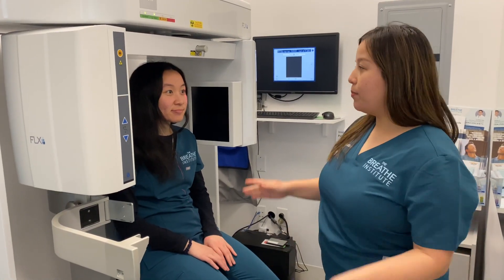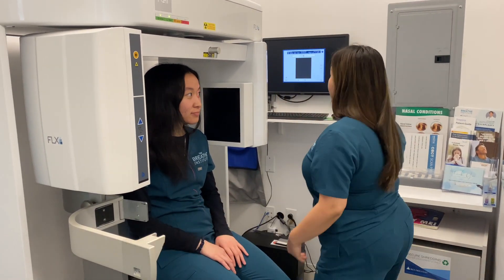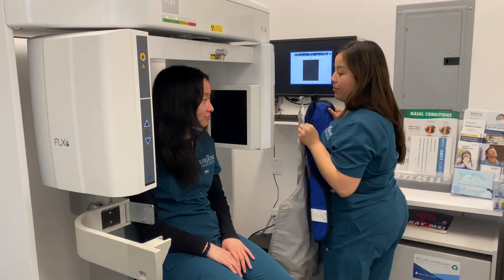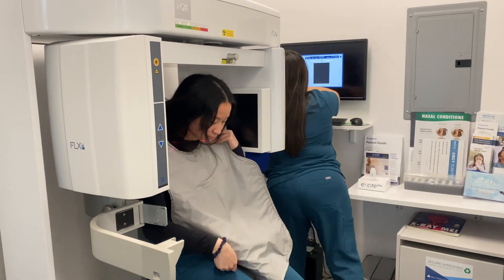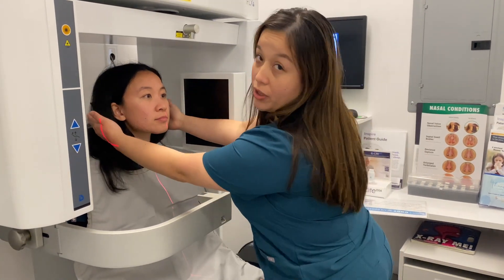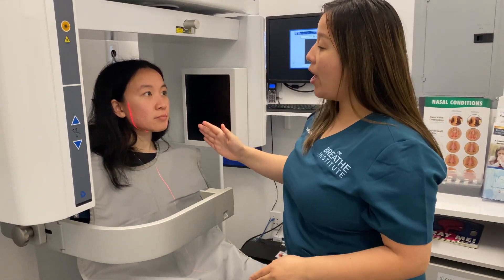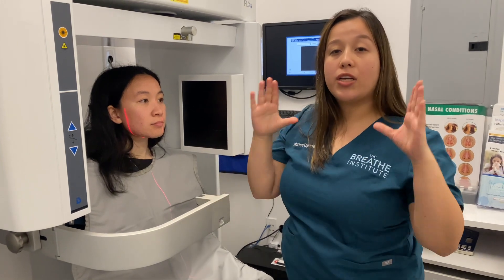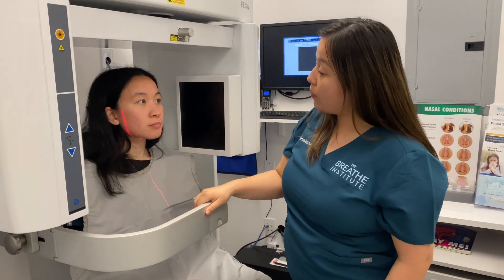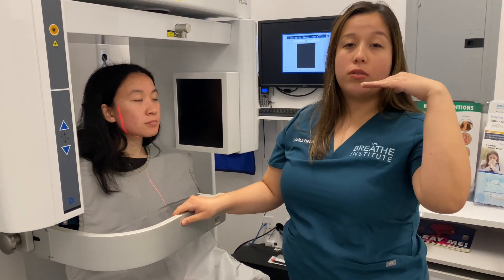The first thing we're going to want to do is position Sam in the correct axial beam. What we're going to do first is put on a safety vest for her. We will ask our patient Sam to go ahead and move all the way back onto the headrest. Once she's positioned properly on the headrest, we are going to move her so that she can be in the correct axial view. What we're going to do is align Sam on the vertical line and on the horizontal line that the CT scan shows.